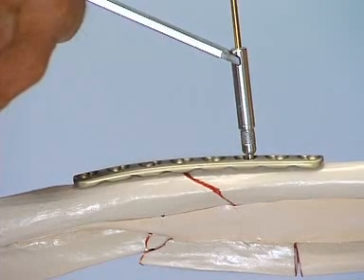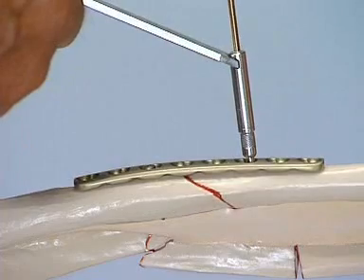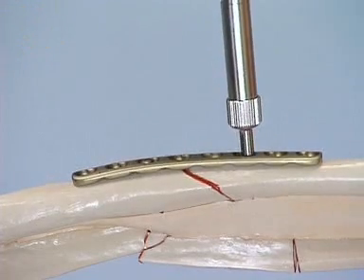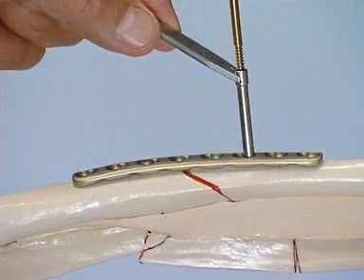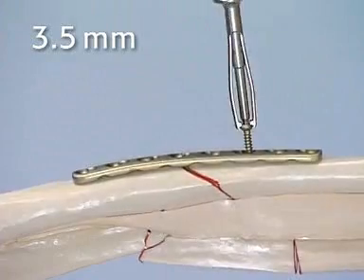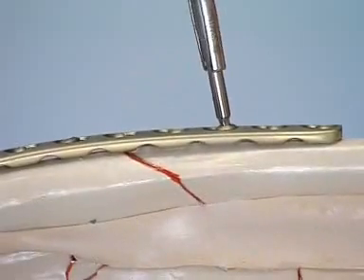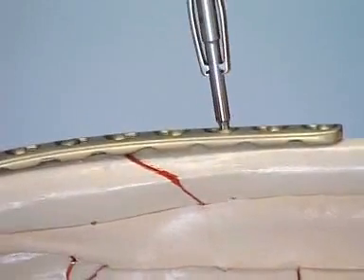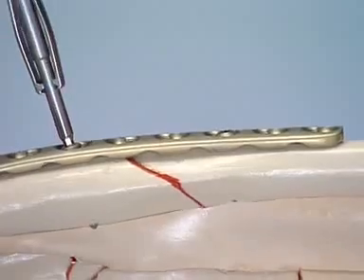To drill eccentrically, the telescopic sleeve of the guide may not be pressed onto the bone; instead, the sleeve is only held against the smooth end of the DC plate hole. The depth is measured and the thread is cut. The appropriate length 3.5-millimeter screw is inserted, and by driving the screw home, axial compression is created. The first screw is then checked for tightness.